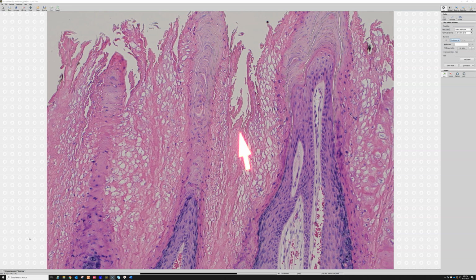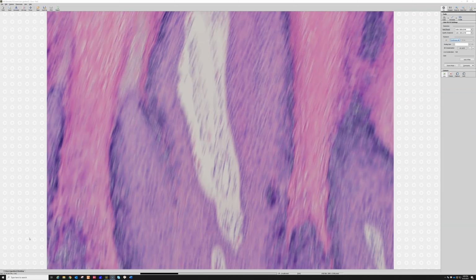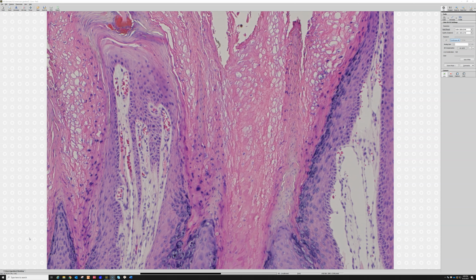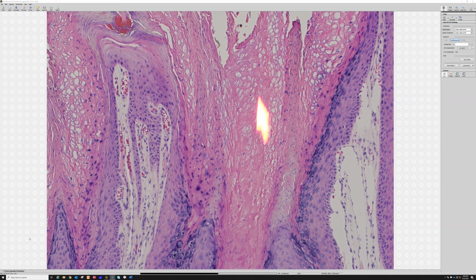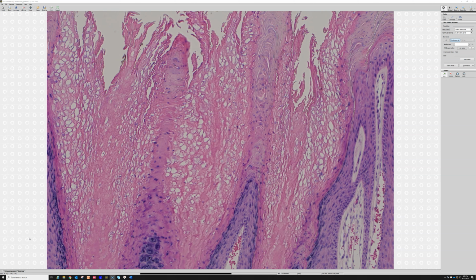Now, it's not always so perfectly structured and organized this way, but that's why I'm showing you the very best wart first, because it's just as perfect as you could ask. In fact, sometimes these towers become so tall, they're like spires. People have called them church spires, like on the old beautiful European churches that have the really tall spiky towers on the top. That's what these have been likened to, these church spires of parakeratosis. And then a lot of orthokeratin intervenes in between, sometimes with scattered parakeratin mingled in there, okay? So the spires or towers of parakeratosis alternating with orthokeratin, that's a classic feature of verruca.